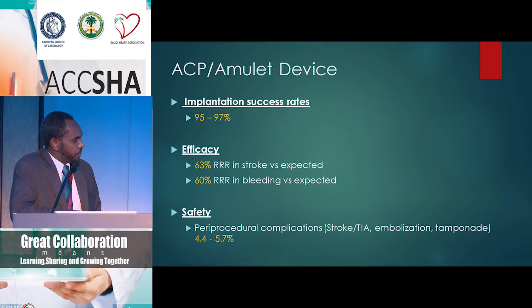So fairly efficacious. Safety profile, again, similar, maybe slightly higher numbers as compared to the WATCHMAN, 4.4 to 5.7% combined stroke, embolization, or tamponade.